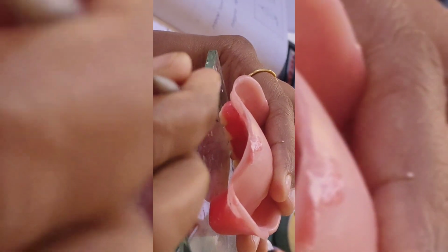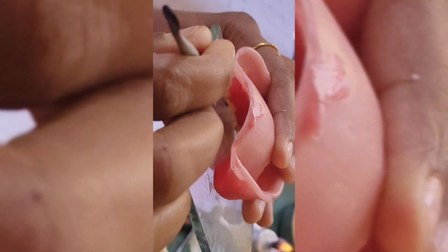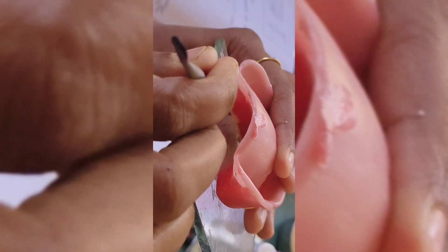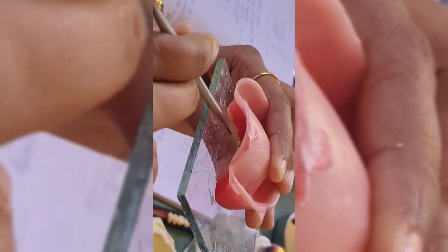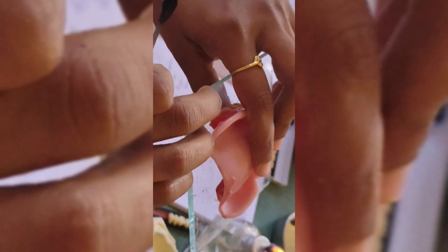Palatally if we see this, nothing is touching. Here this palate is touching. Here, see, the distopalatal is not touching. From here we see. So this is what you have to do for the maxillary posterior.